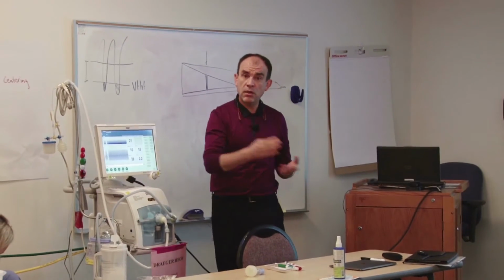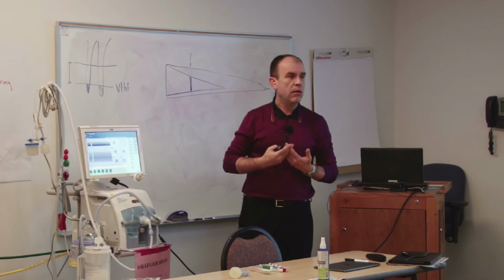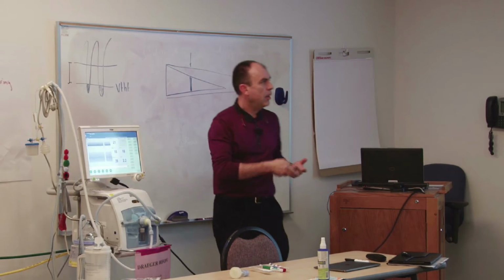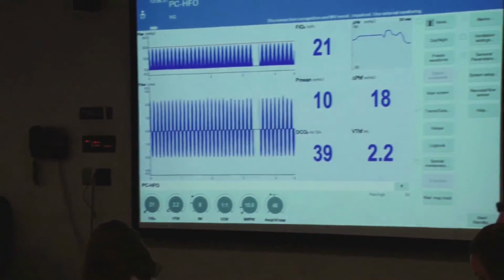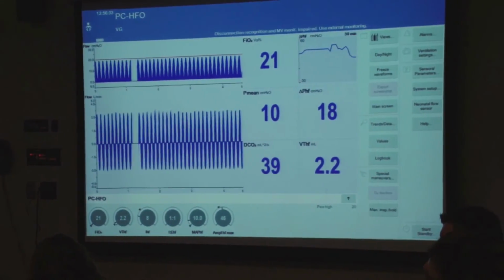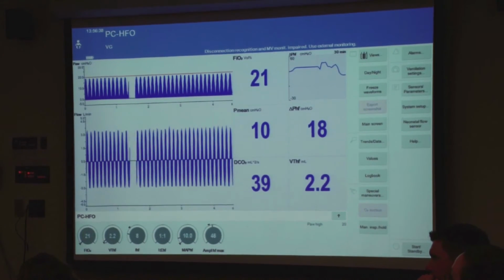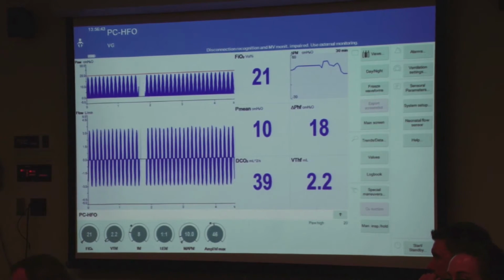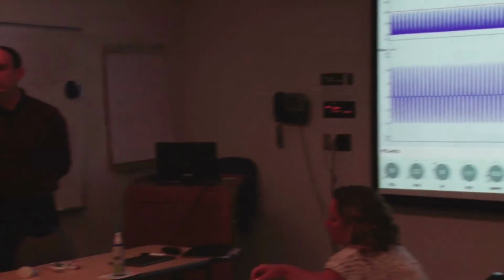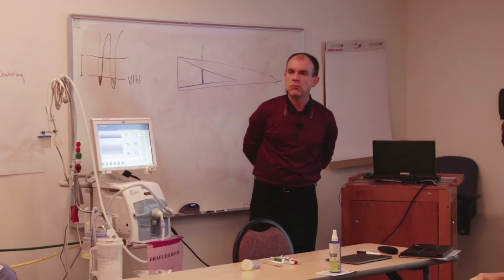So, the same as volume guarantee in conventional ventilation, it has a way of weaning the baby, lowering the delta P or the amplitude to a point where you say, probably we could do well with a conventional ventilator. Are you allowed in the protocol to extubate from high frequency? Okay. We'll extubate to bubble CPAP, because that's what we use here, and we want to stick to our standard care.